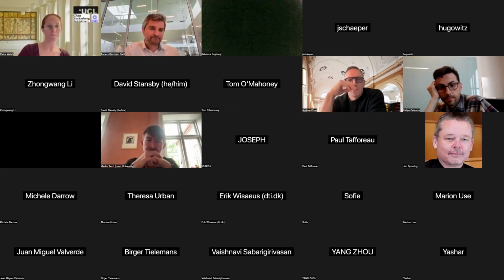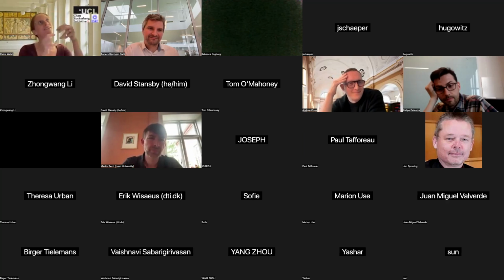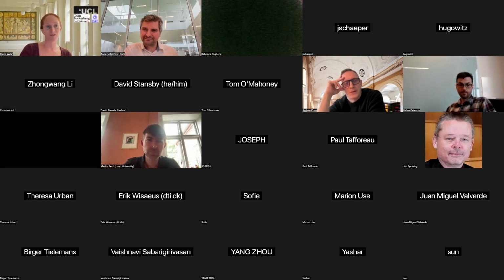So Claire? I think in terms of a comment on trying to decide on an image processing technique to use, and I think it's the same for a lot of the talks we saw today, is what's the final biological quantitative output you want out of it? And that has a really big dictation impact on what you use. Are you looking to extract the morphology of it? Do you want to know the volume compared to volumes in others? Do you just want to know the start and the end points? And I think that comes with a lot of stuff. So what process you use depends on what the question you want to answer is, and how much precision you need in the answer of that question for it to be useful.